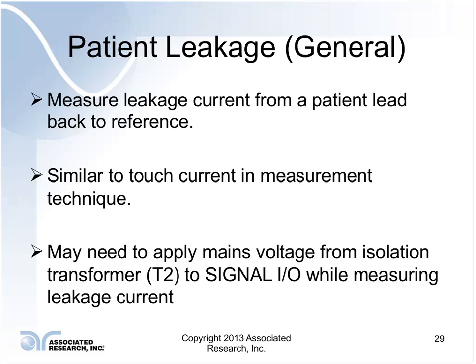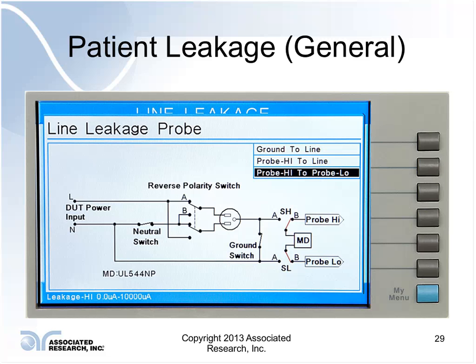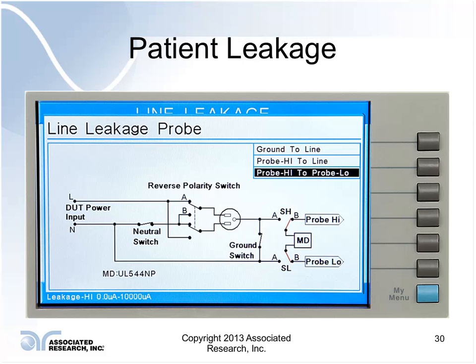Now, I'm not going to get too in-depth on that one, and I know it's a tricky one, and I know if you have questions on it, you can always reach out and contact us because we have dealt with these types of tests before. And actually, in a few minutes here, I'm going to show you an example of such a test. So for patient leakage, we're going to have a very similar scenario.